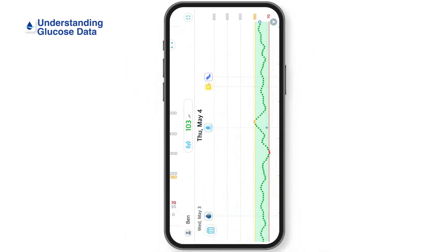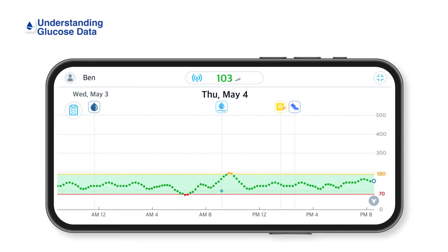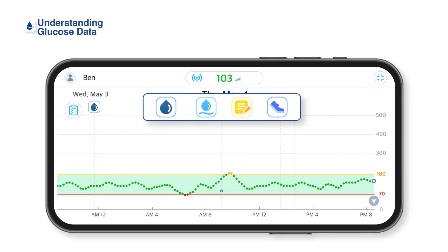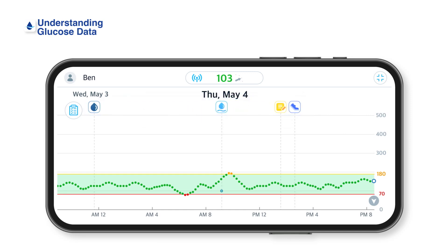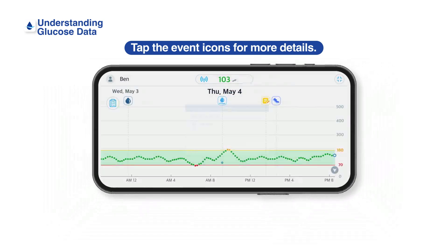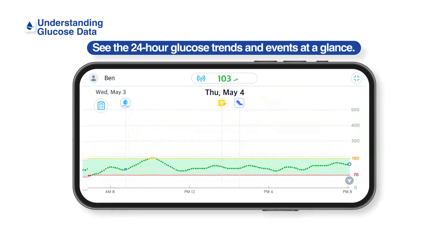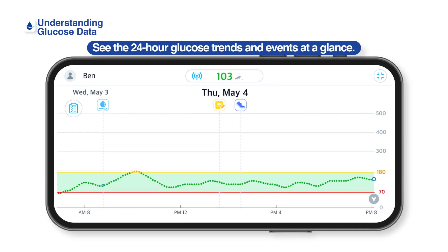Tap the Screen Mode icon on the home screen to see your glucose trend in more detail. In the Horizontal Mode, you can see recorded events along with your glucose trends. Each event is displayed with an icon above the timeline. Tap the Event icon for more details. You can see the 24-hour glucose trends and events. Zoom in with your fingers to see 6- or 12-hour trends.